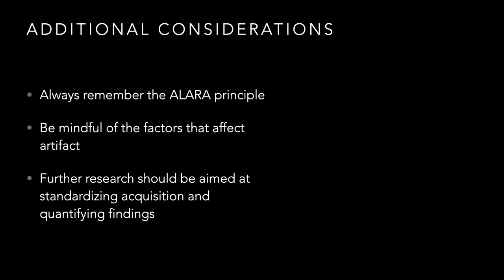And I think where this becomes really important, it kind of ties into the last point, is now that lung ultrasound has been established as a thing, right? 10 years ago, it was like, wow, this is kind of interesting. People were still getting used to it and it wasn't as ubiquitous as it may be now. Maybe we have to go back a little more than 10 years because it was pretty much a thing then, right? But now that this has become a very standard part of bedside POCUS, bedside lung ultrasound, we need to start eliminating some of the variables, presets for example, that may affect our ability to get really solid quantitative data, right?